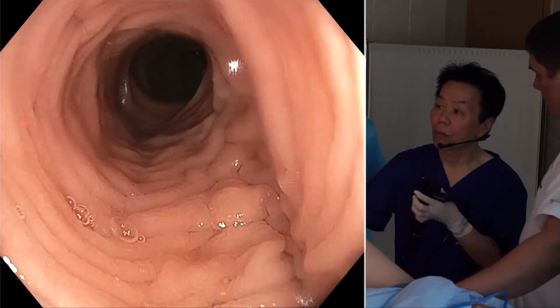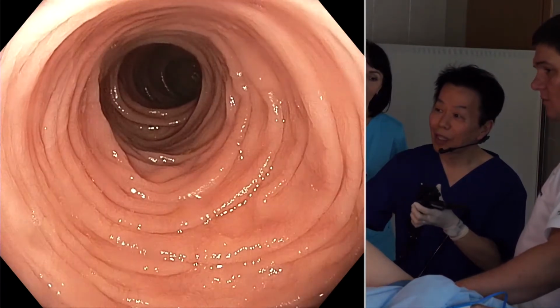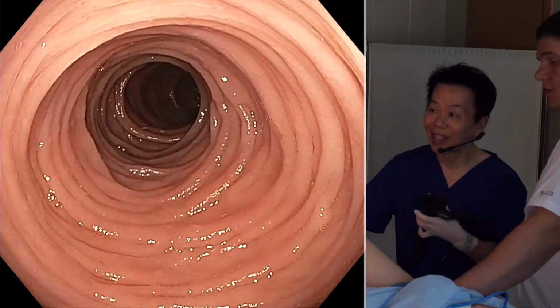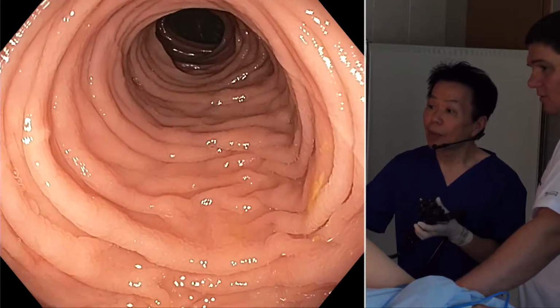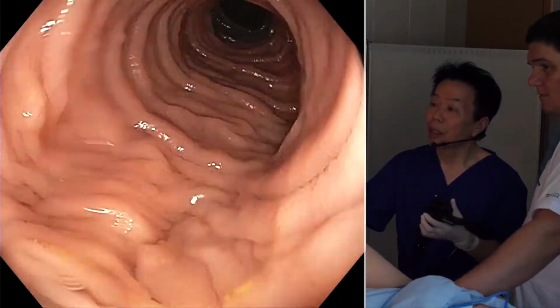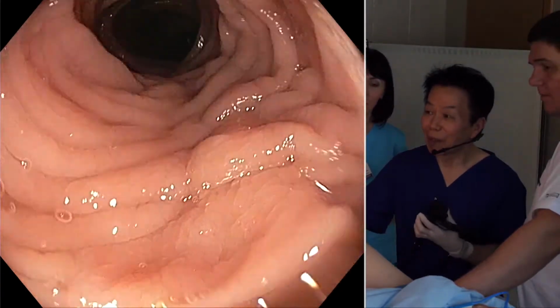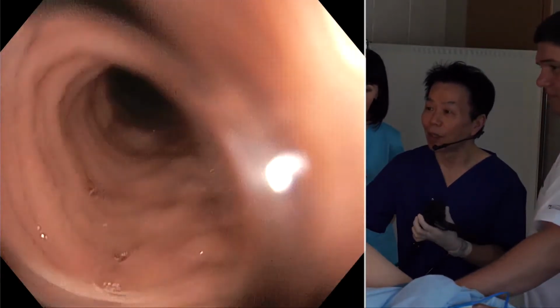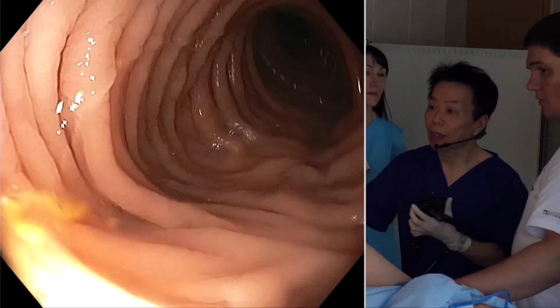How do you find the bowel preparation in this case? Not bad. Maybe we don't routinely use the Boston scale, but maybe Boston scale 2. In this case, we use same-day preparation. I think same-day preparation is better than split dose. Split dose is better than the day-before dosage, but same-day dose is better than split dose, I think, if the patient goes to an afternoon colonoscopy. That's right.